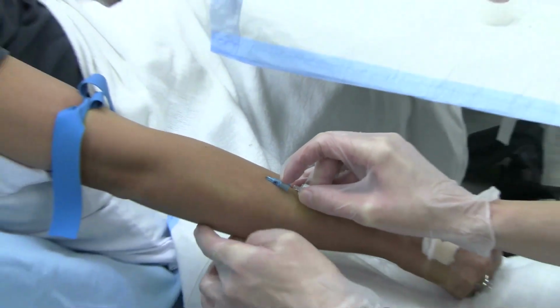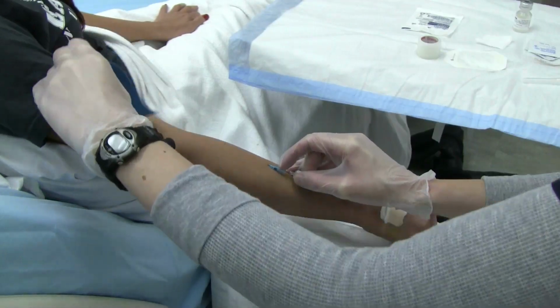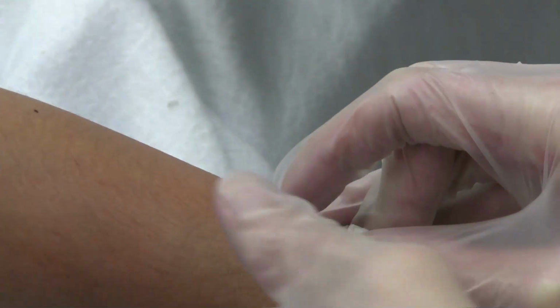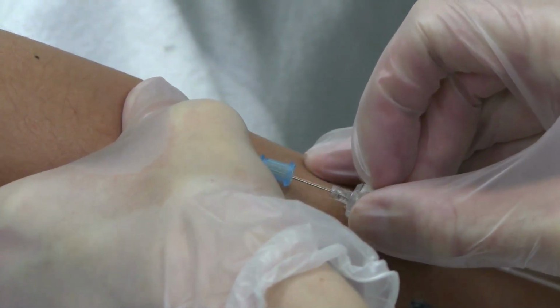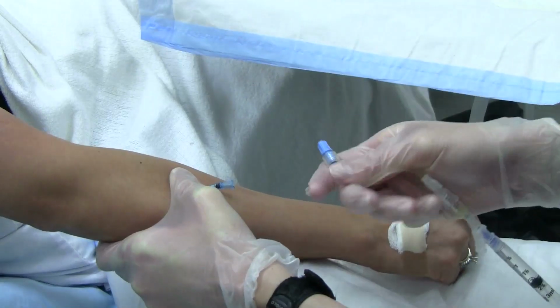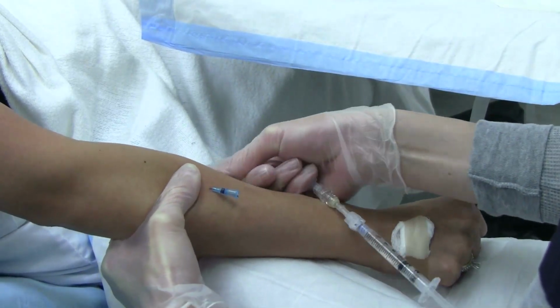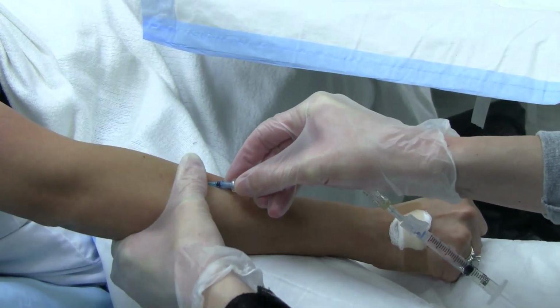Hold the needle assembly in a steady manner. Advance the catheter until the hub is at the venipuncture site. Release the tourniquet. Carefully remove stylet and engage the needle safety device and immediately put pressure on the vein proximal to the catheter to eliminate or reduce blood oozing out of the catheter.